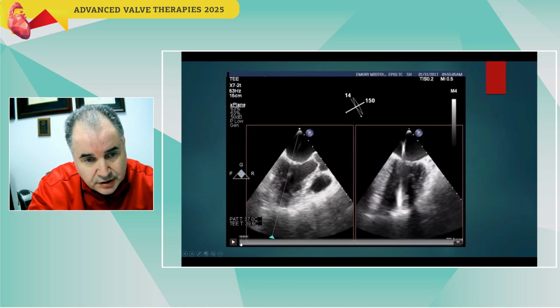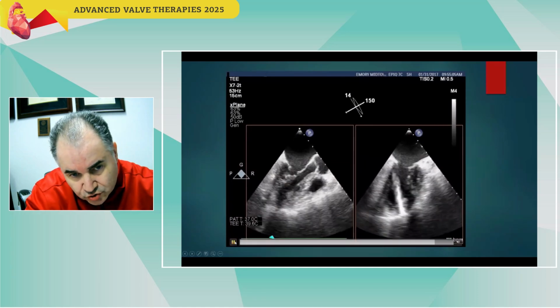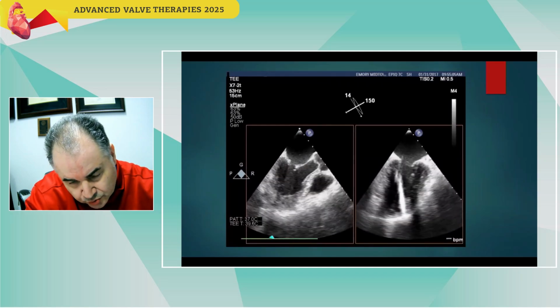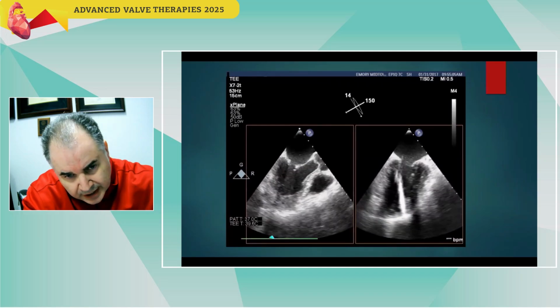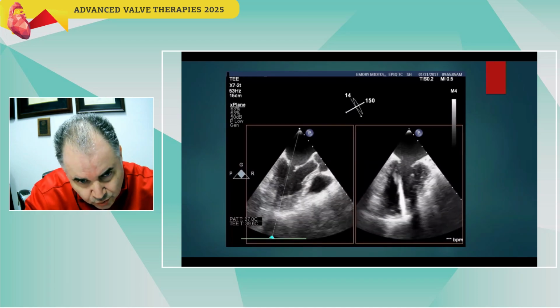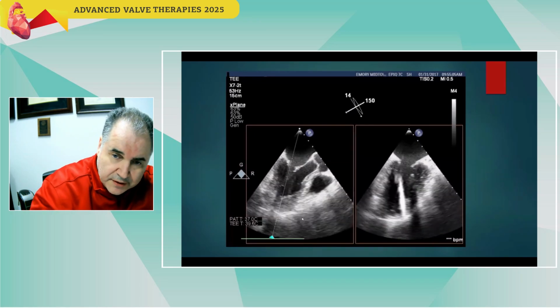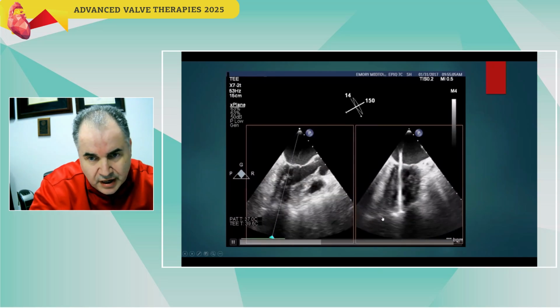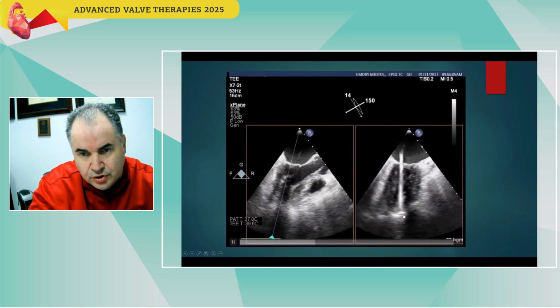And as you can see here, this is actually the surgeon, Dr. Guyton in Emory, pointing with his finger to where the catheter has to cross from the apex, and it's a straight shot. Actually, very easy procedure if you do it.